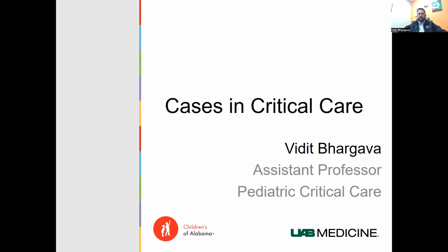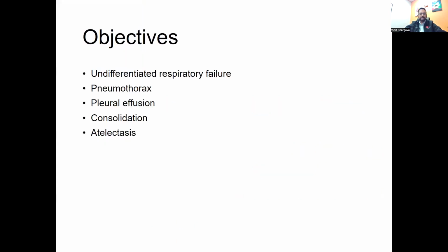I acknowledge that for this year, we haven't quite done the lung lectures yet. So I'll try to point out the pathology, but it wouldn't be everything that we're going to hear in the next 1 or 2 lectures about lung ultrasound. If you have questions about something, or about one of the artifacts or findings, please stop me and let me know.